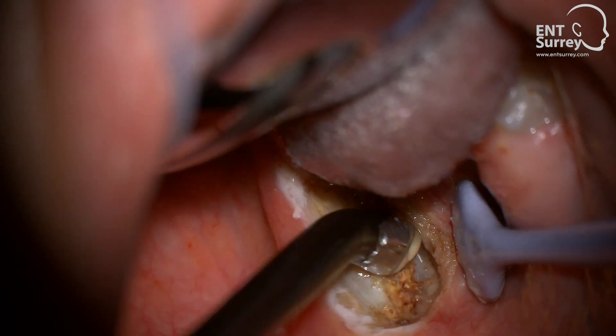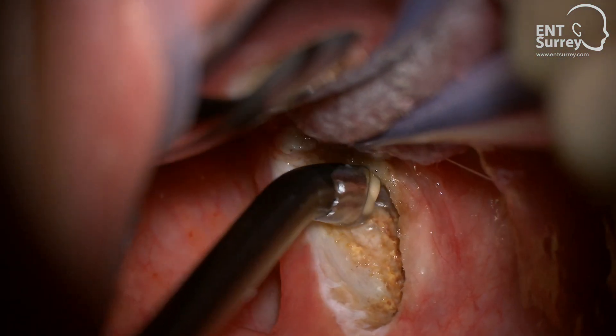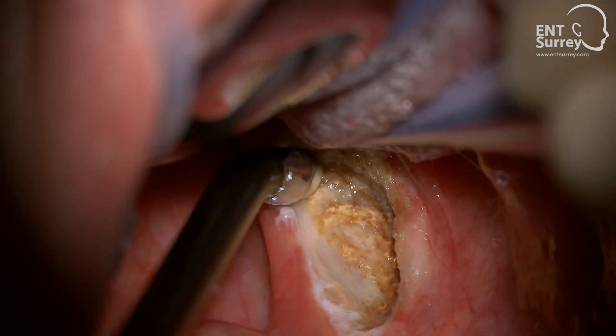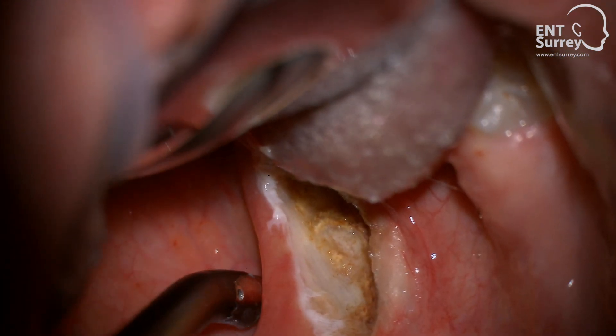Good retraction is essential to ensuring all tonsil tissue is removed. The retractor can be used to lateralise the anterior pillar, or as shown here, retracting the base of the tongue away from the inferior pole. In larger tonsils, the retractor can also be used to protect structures such as the posterior pharyngeal wall or uvula.